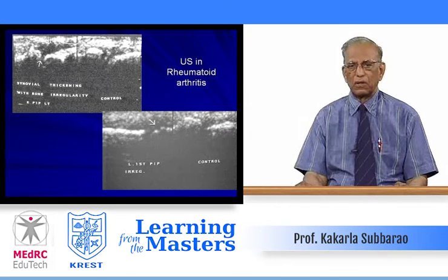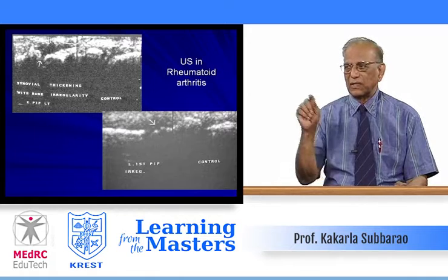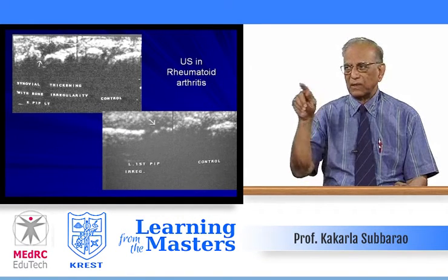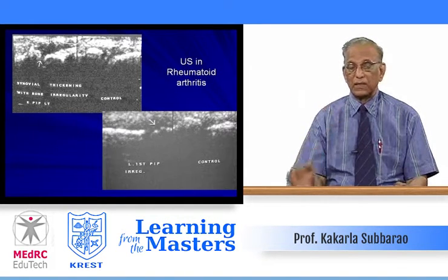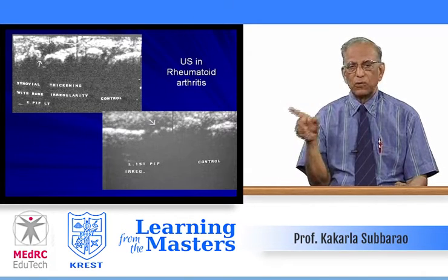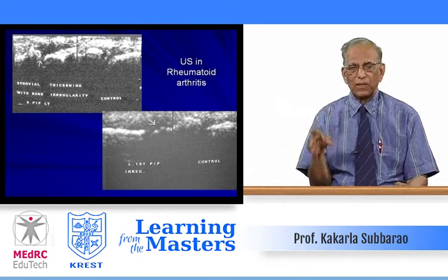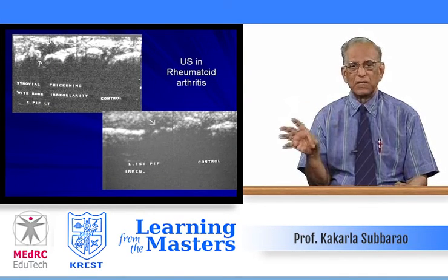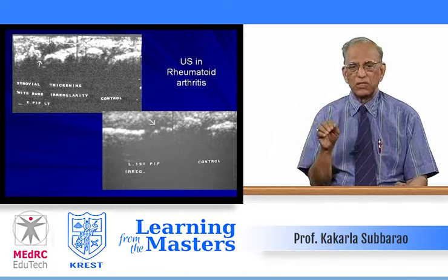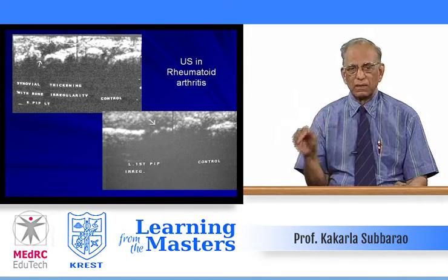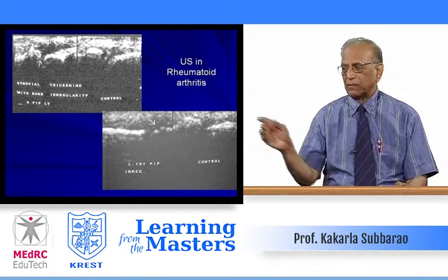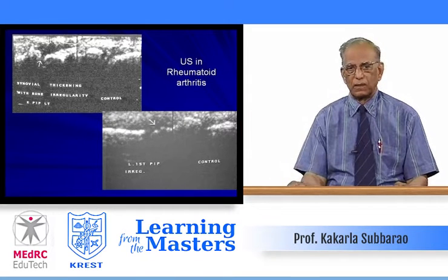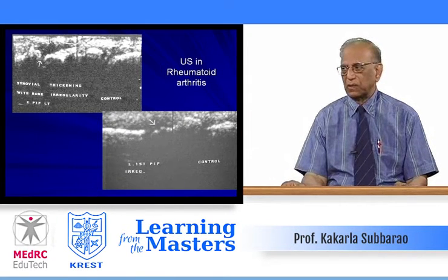For example, in rheumatoid arthritis, look at these pictures. You could see the synovial thickening by the irregularity. The terms we use in ultrasonography are echogenic areas, anechoic areas, hypoechoic areas, or mixed echoes. On the right-hand side, the lower picture shows early erosions. On a plain film of the hand, early erosions may not be seen unless 40% of the cortex is destroyed.